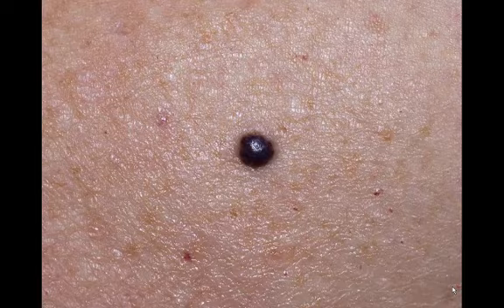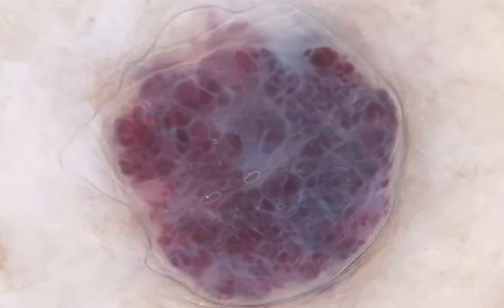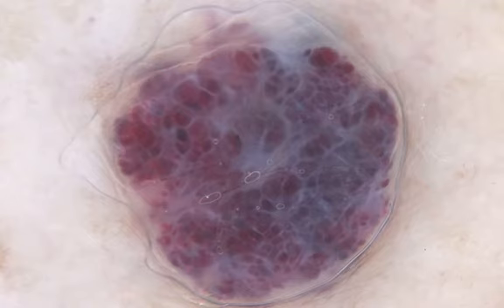a lesion viewed clinically. Then with dermatoscopy, which pattern? Well, the structure is clods, so we have a pattern of clods. Which color? Red and purple, so you know the diagnosis. It's an angioma.